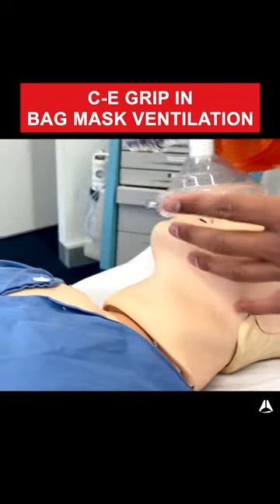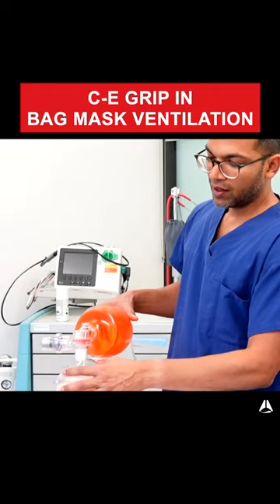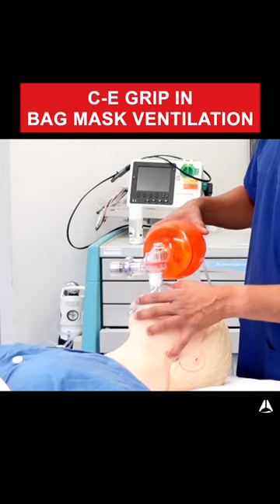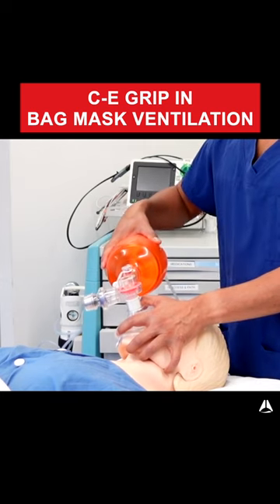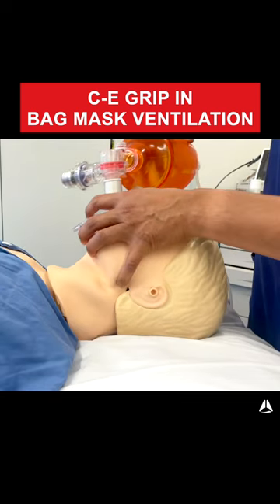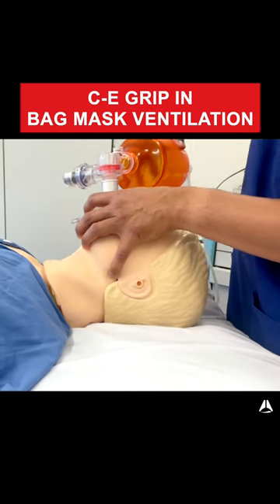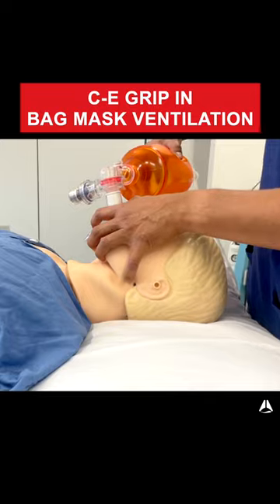Once you've got this CE grip, one of the really important things to note is that you want to try and lift the face towards the mask, so you're not pushing down, because that obstructs all the structures. Lifting up opens up the airway and tries to align those three axes, whereas pushing down on the face really doesn't help — it makes the angle more acute.